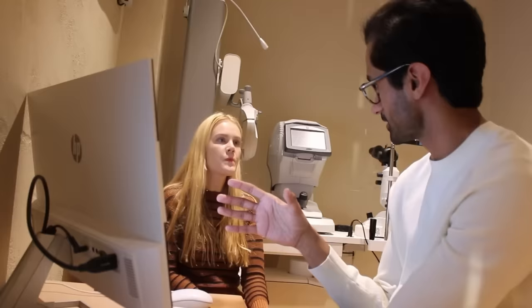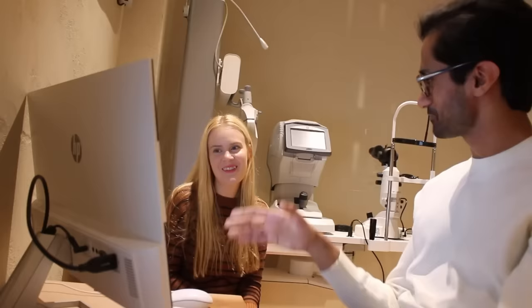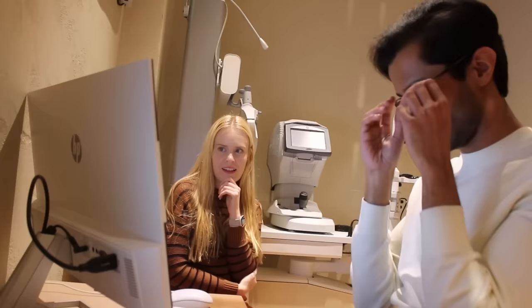By the future, how often do you recommend I get my eyes checked? Probably 2 years. Unless you feel a change, but I think 2 years at a maximum would be a good idea. So that's how you compare the data, every 2 years. It's really interesting hearing all the reasoning behind it. You just see the numbers all the time and you don't really know what they mean half the time. Any questions? I think that was my main question for now.